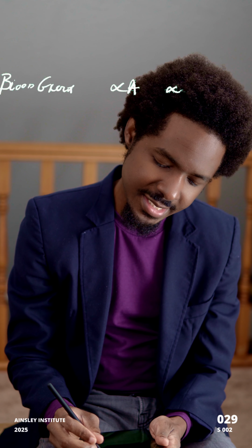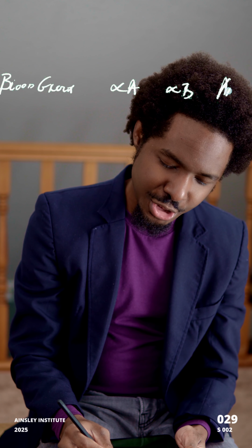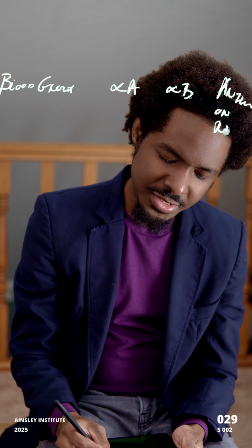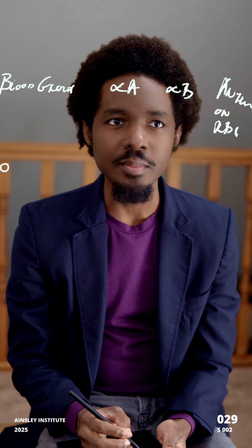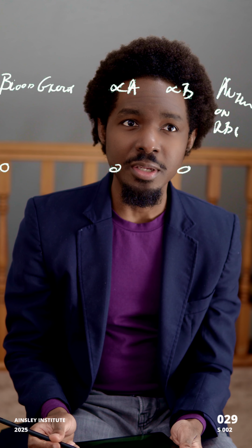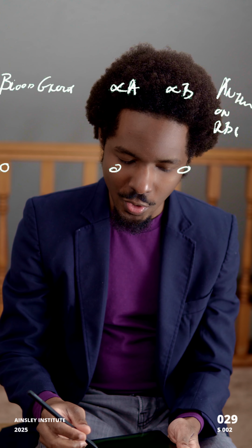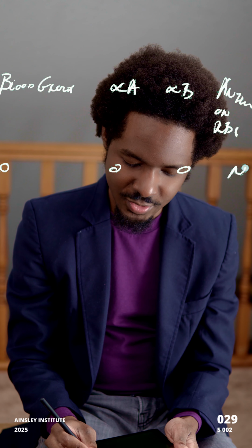Then we're going to say this is anti-sera B, and we're going to come to the conclusion of the antigens on RBC, red blood cells. All right, so a person who is O, we are expecting no reaction with the A, no reaction with the B, right? Because there are no A or B on the red blood cells, so there is none.